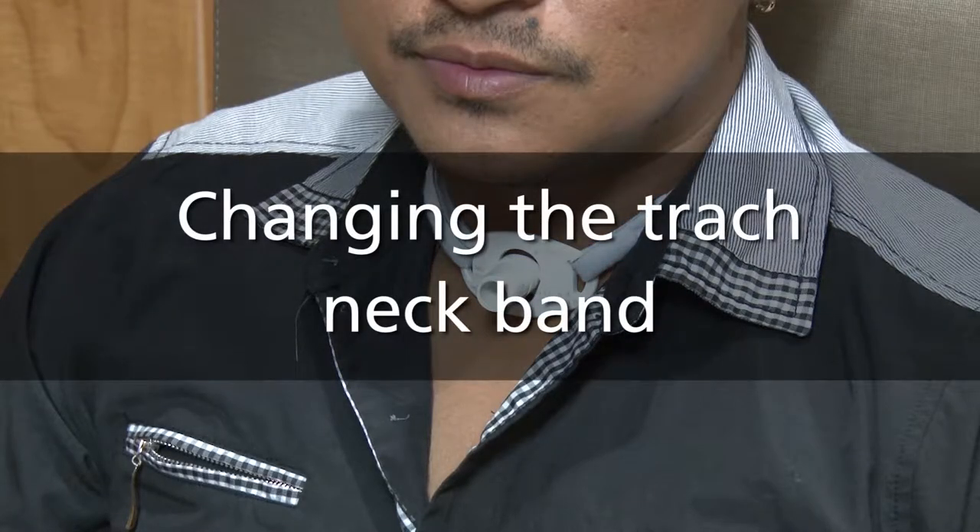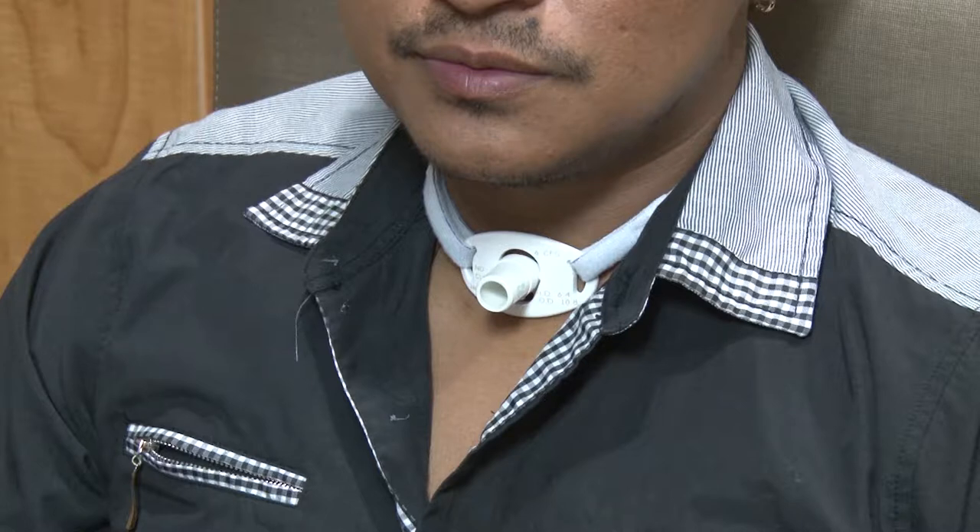The strap around your neck that holds your trach in place is called the trach tie or the Velcro neckband. This neckband should be thrown away when it is dirty or worn out. This video will show you how to change the band.